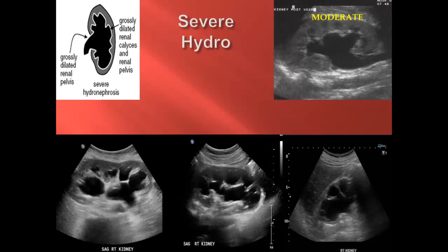Please take a moment to review the spectrum of severe hydronephrosis. Recall the features of severe hydro: complete obliteration of the renal sinus and the medullary pyramids by the anechoic bag of urine, and variable degree of cortical thinning.